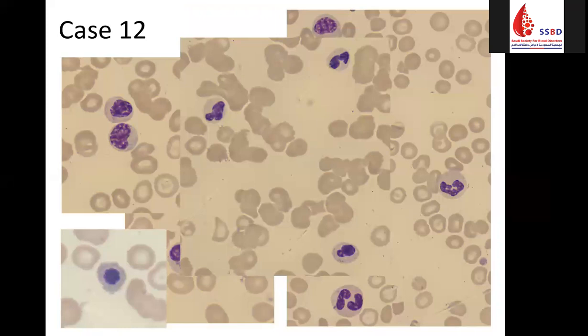So, an adult patient of 60 and more age, persistent pancytopenia, dysplastic change in the granulocytic cells, the neutrophils, and the available nucleated RBCs. So you need to make sure that these dysplastic changes are in more than 10% of the available lineage, and definitely in this case, it's more than 10% in the peripheral blood. However, you need to do your bone marrow.